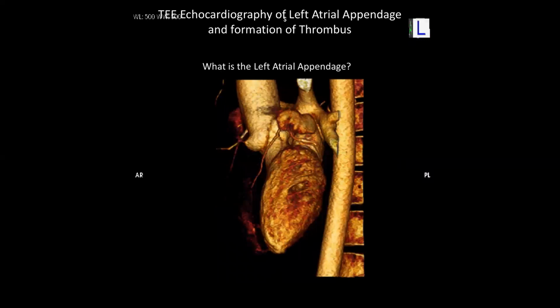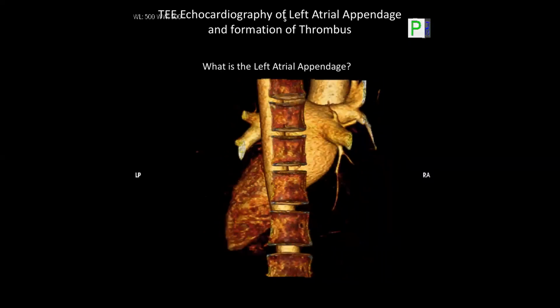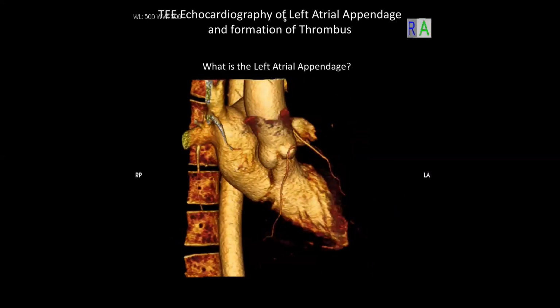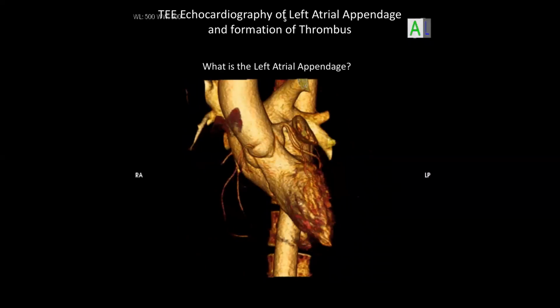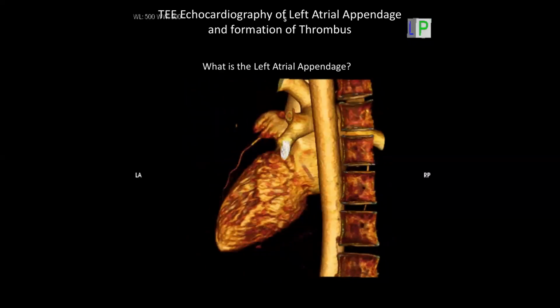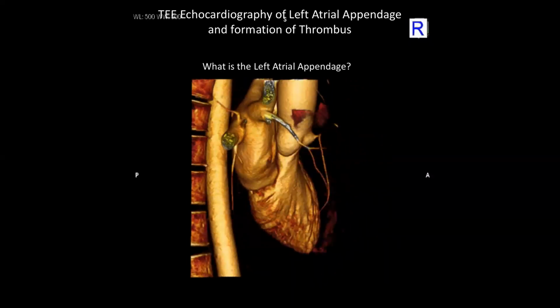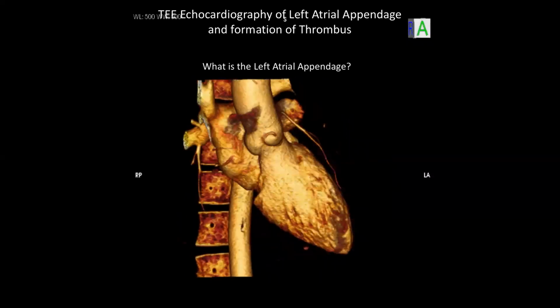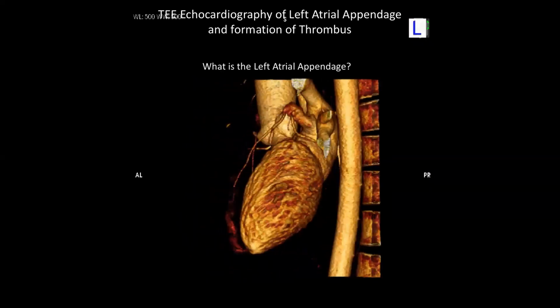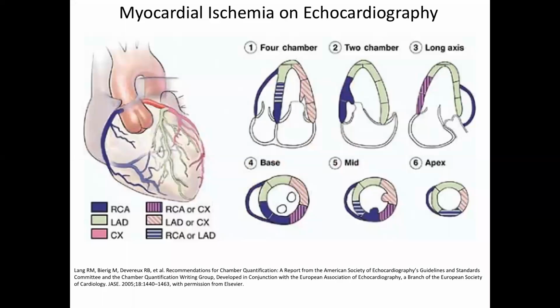And spectacular time resolution, right? For CT. Sorry to go off into CT, this scanner has 2 detectors, 90 degrees apart. So not only does it have a 6 centimeter detector with 64 slices or whatever, it's got 2 of those. They put another one at 90 degrees. So now you can get the image done in half the time, and you get these crazy high resolution pictures.